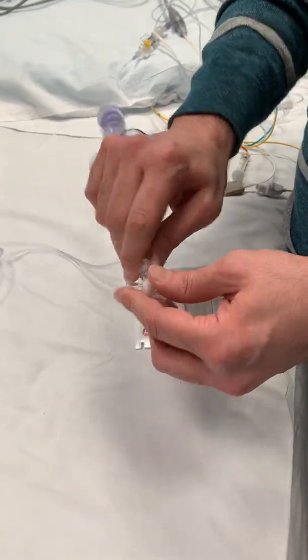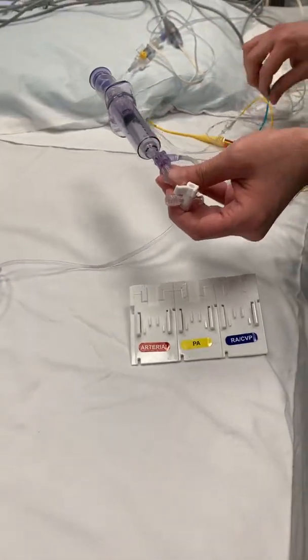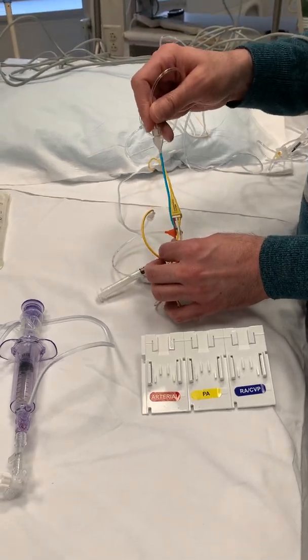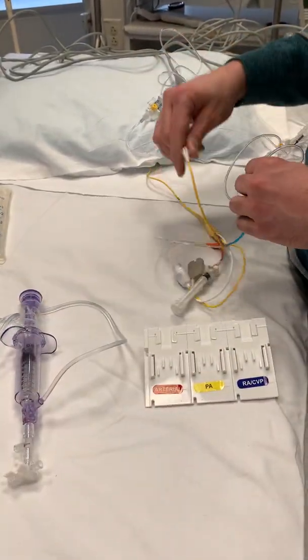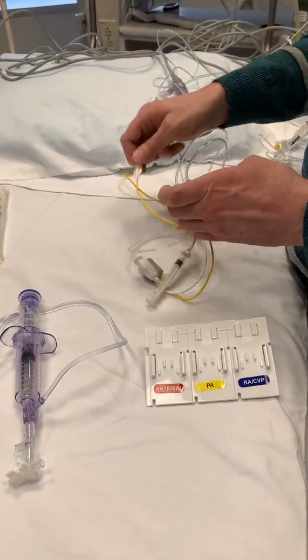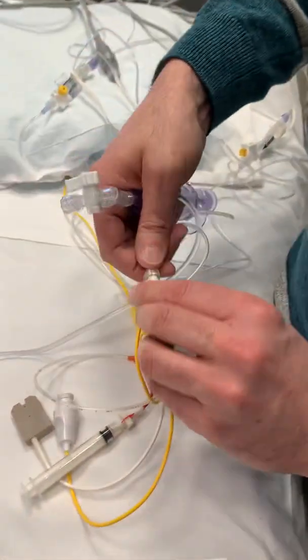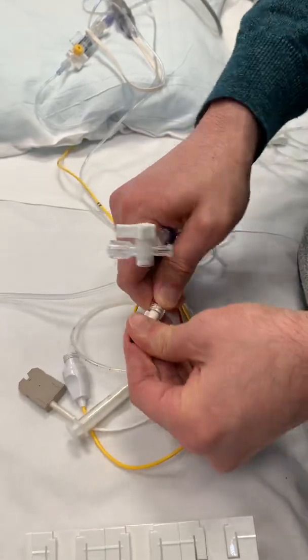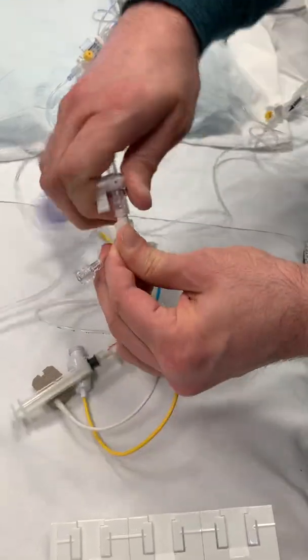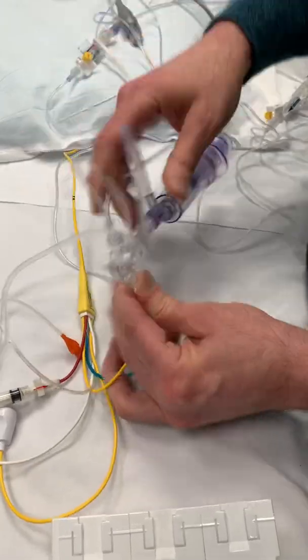For the cardiac output, you're going to connect this to your three-way stopcock. This goes on always on the CVP port — you don't ever put your cardiac output on your PA port because then you would be bolusing into the PA artery. You don't want to bolus anything into the pulmonary artery because you can rupture the artery. So this is just going to connect onto here. You're probably going to have to bend this over so you don't let the blood back up. It only goes one way — male to female on this side, and male to female on this side.